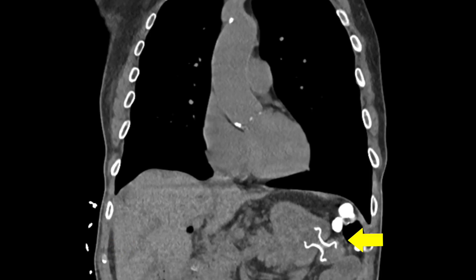CT performed 24 hours after the procedure confirms correct position of the gastrojejunostomy stent.